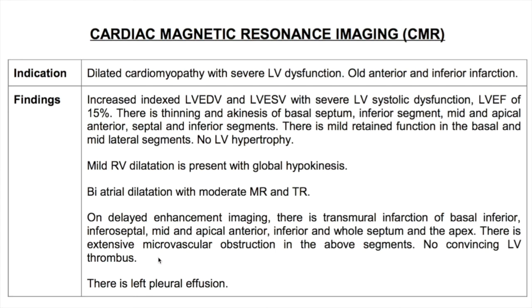The section on anatomy comes in across here. If there is left pleural effusion, we have mentioned it under extracardiac anatomy. We talk about atrial dimensions and the valvular status. We do talk about the right ventricular dimensions and we talk about the wall motion abnormality.